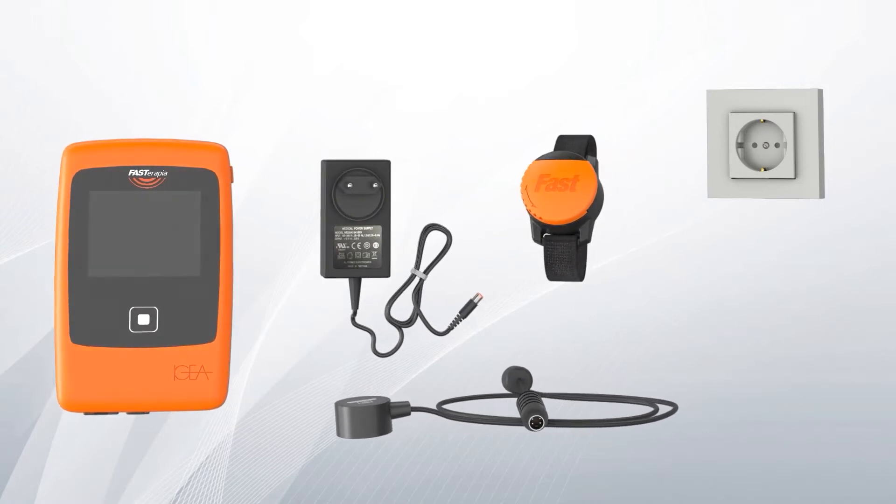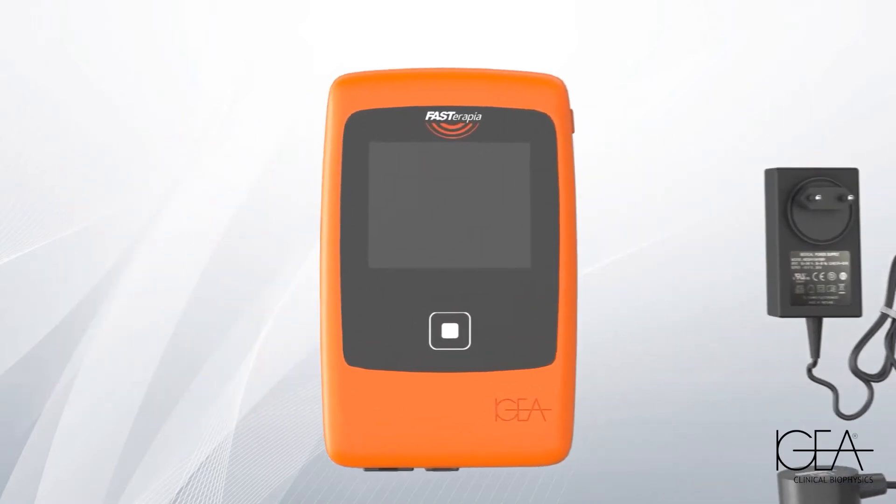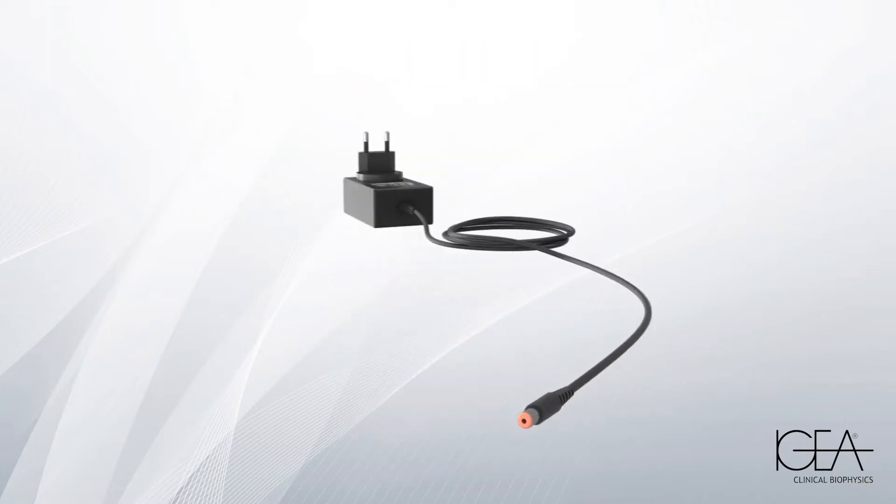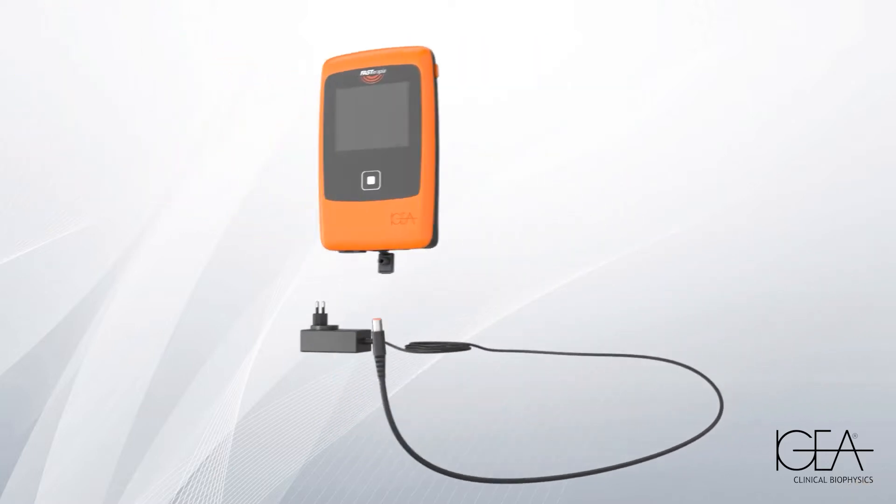Fast Therapy is an innovative medical device that accelerates the healing of a fracture in just 20 minutes a day, reducing recovery times. It is very simple to use. To fully charge the battery, connect the generator to the charger.